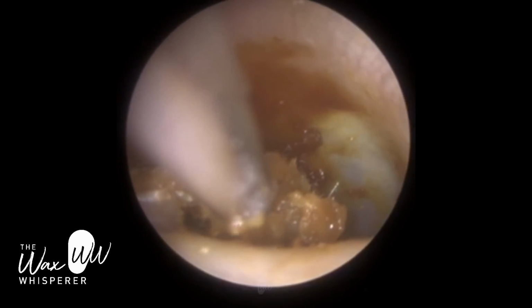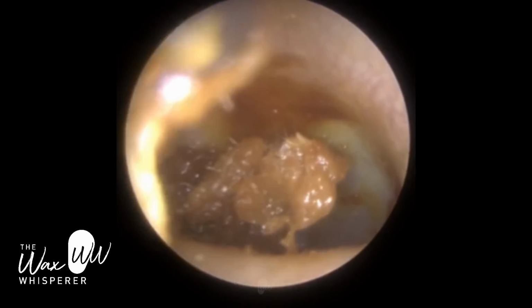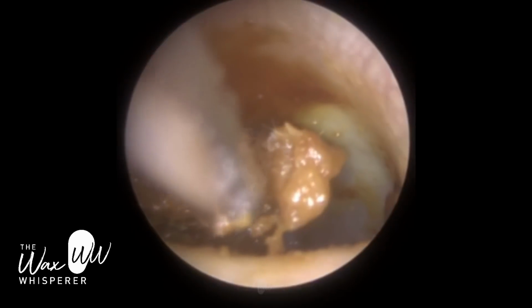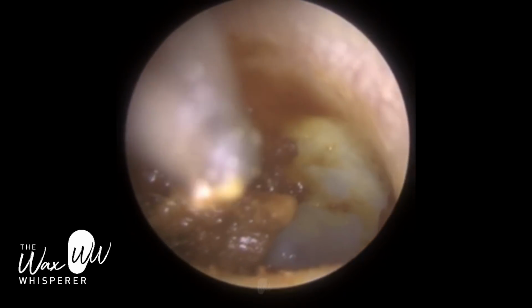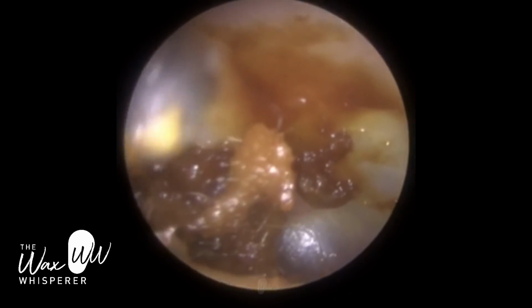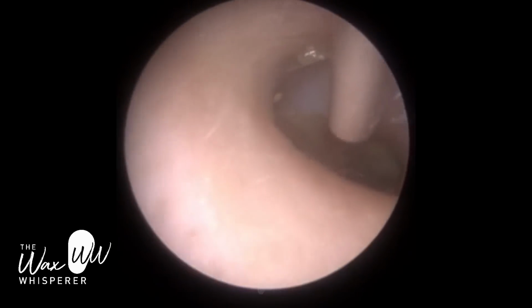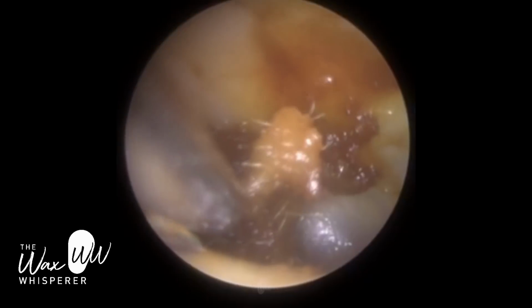Unfortunately, the patient would also use a cotton bud and really impacted this wax deep in the ear, in the recesses. About a half centimetre away from the eardrum, the ear canal narrows and protrudes outwards. It's called the isthmus, and that creates a trench, it creates recesses, little caves. She had one inferiorly at the bottom of the ear canal and one anteriorly to the left-hand side, as we're viewing now. And the patient had managed to get the wax lodged.